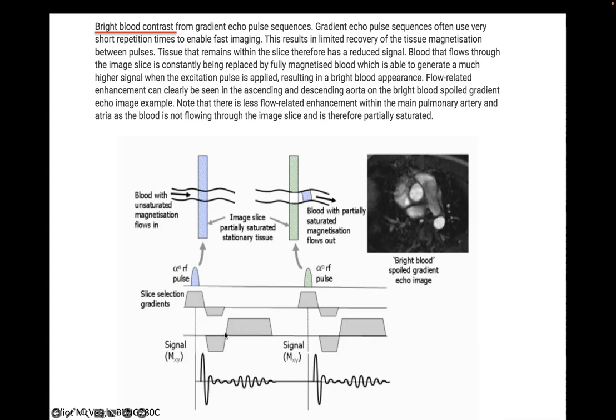The issue with making them any shorter than they are now is that you start to stimulate peripheral nerve activity in the patient. Let me rephrase. I don't think you stimulate neurological activity, but you stimulate peripheral nerve firing. And so you can feel like a twinge, and involuntary motions and things like that when you switch really fast. So you don't want to do that. So we bring this as close as possible.